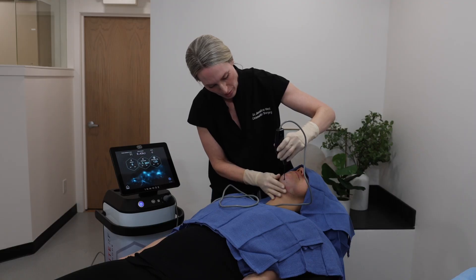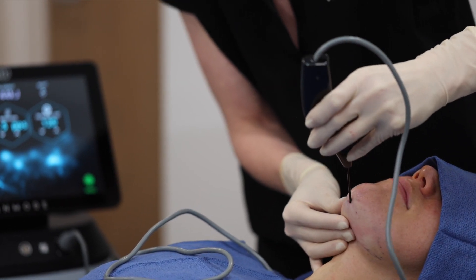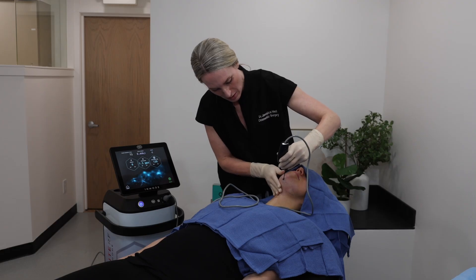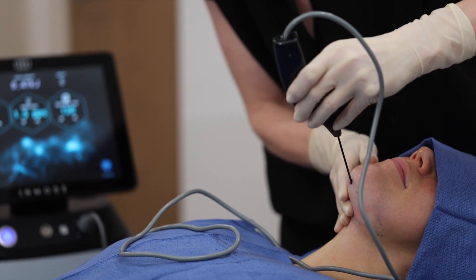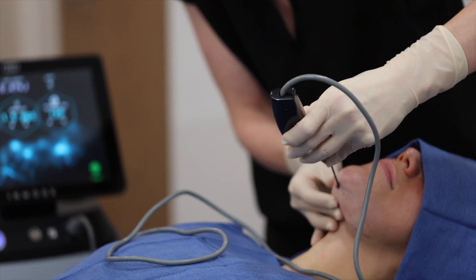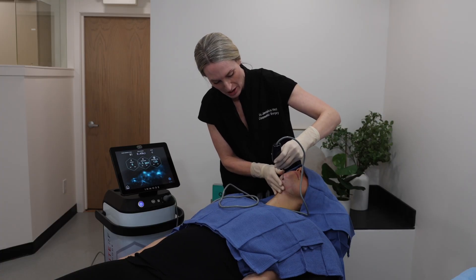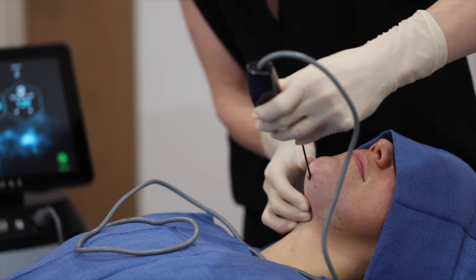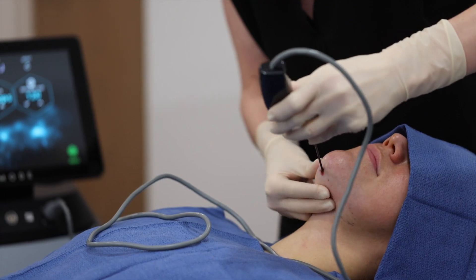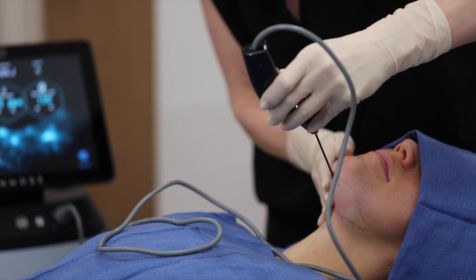Right now we're applying radio frequency energy into that little pocket of fatty adipose tissue. I'm making sure I cover the entire area, and I can actively hear the fat crackling and popping as it's being melted away. I'm using my right hand to feel the probe under the skin.